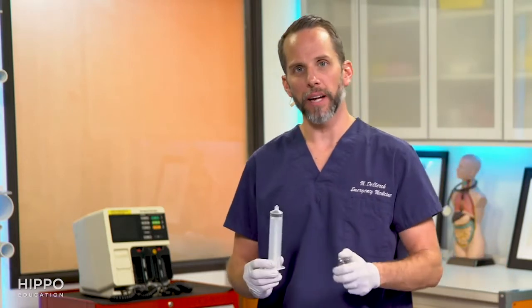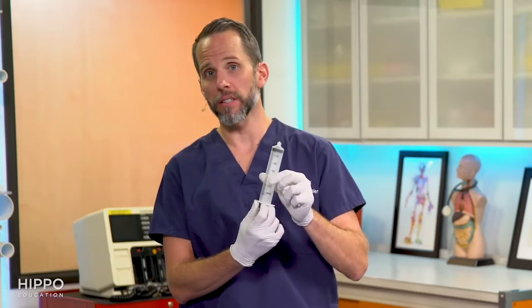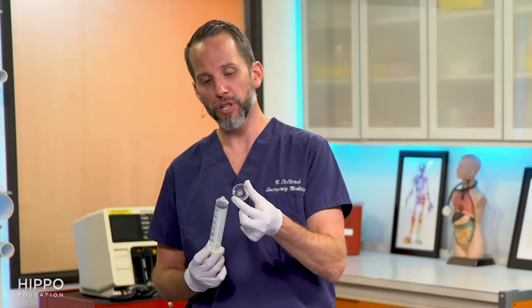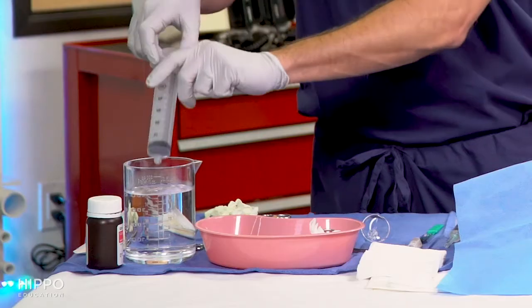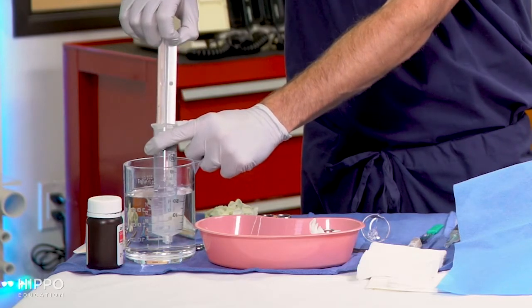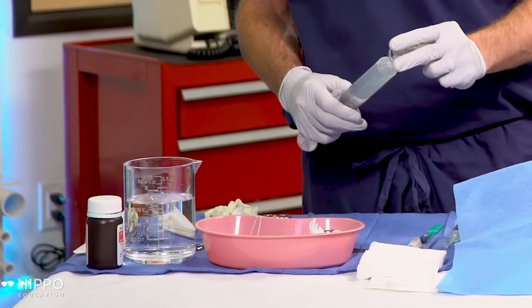So after the blunt dissection opening, you're going to want to irrigate that abscess. You basically get a large syringe. I like a 60 cc, 30 cc is fine. Oftentimes they'll come with a little protective cap that pushes the water in, but also protects from the spray back from coming at you, which is helpful. Normal saline works well. You can use tap water if you need to, but usually normal saline is nice and clean. You don't have to worry about any contamination.